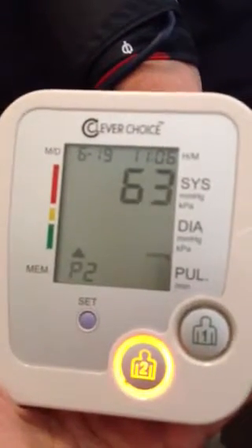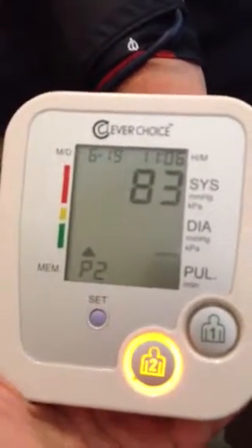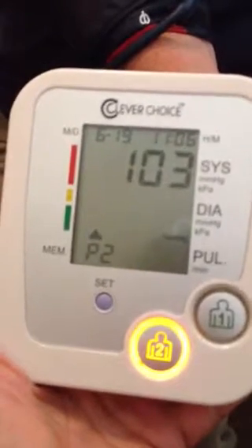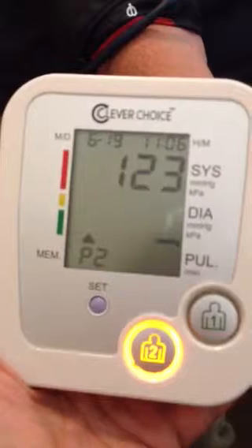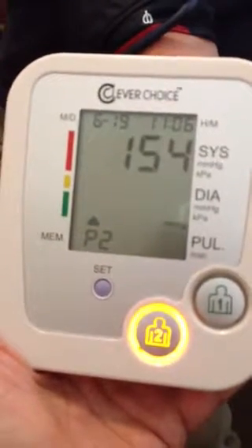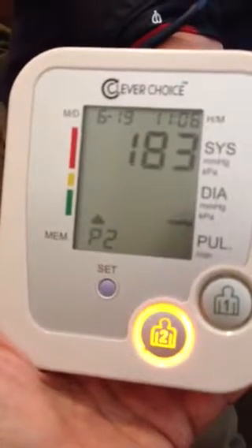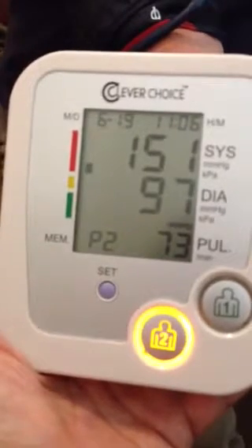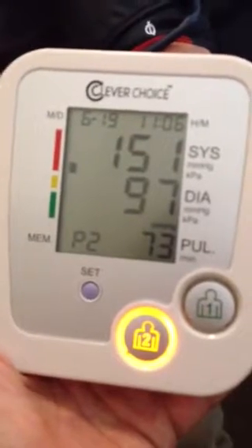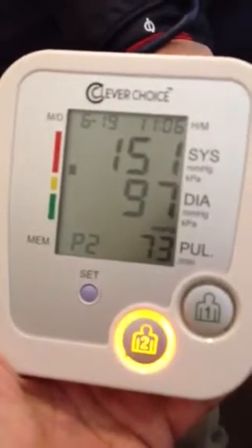Another thing of note: if you see the letter E, that means you've got an error. I've found that it usually means you just don't have it tight enough. Okay, 151 over 97, which is correct for this particular person, with a heart rate of 73.